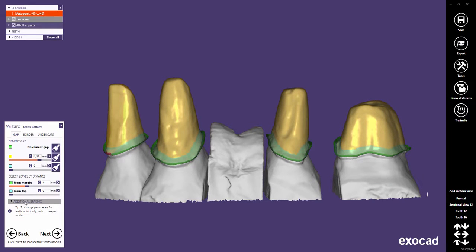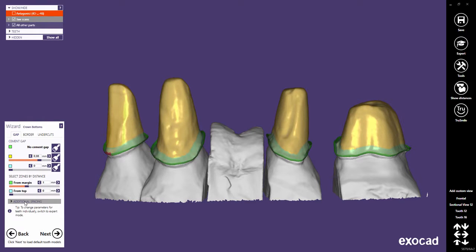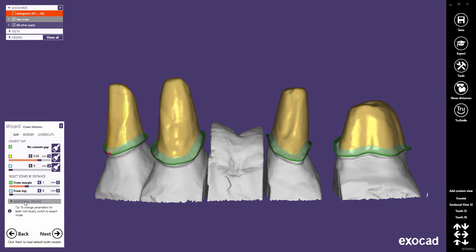Additional spacing allows you to add additional offset spacing to the entire crown bottom, independent of the cement gap. This means that the cement gap will be applied on top of the additional spacing.